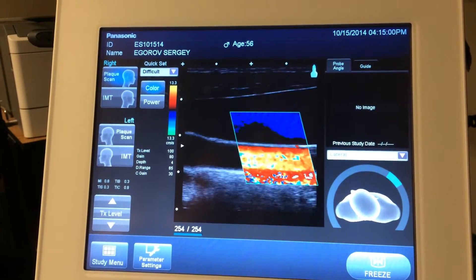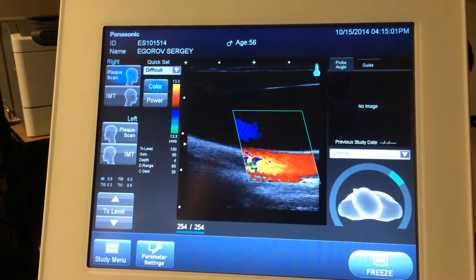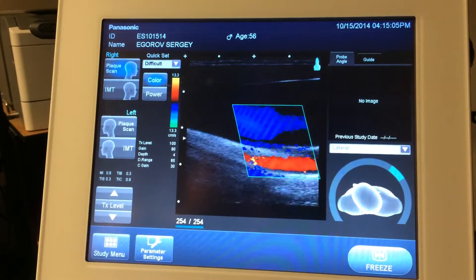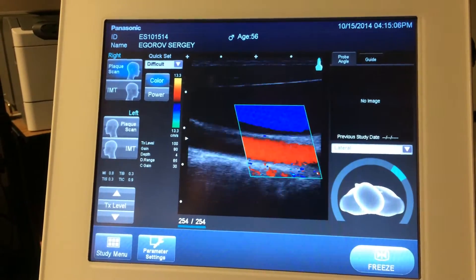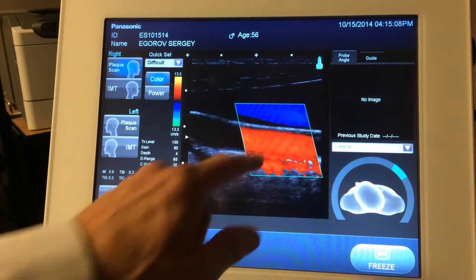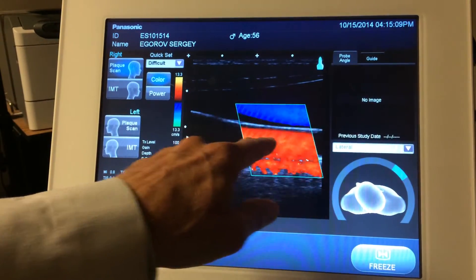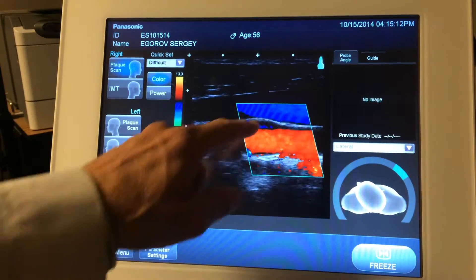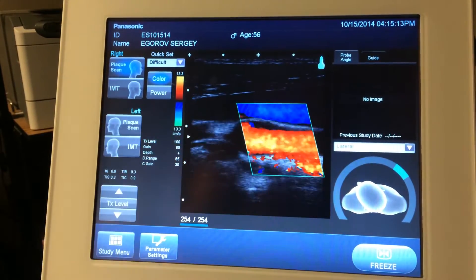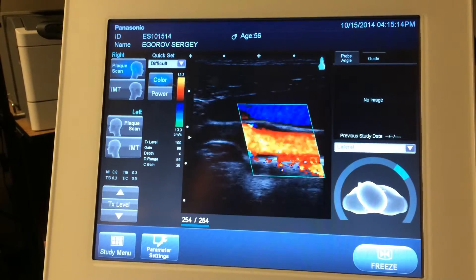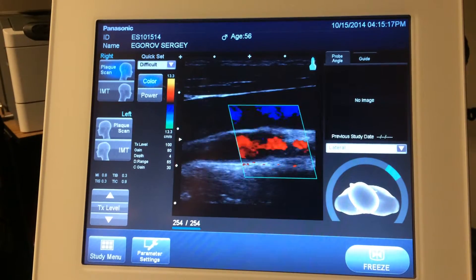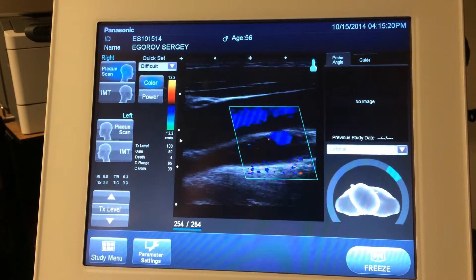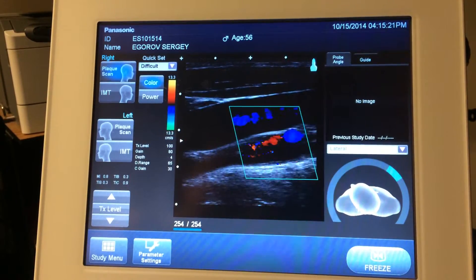And we go back this way. So we can follow your artery down towards the base of your neck, or we can follow it up towards your head. This is called the common carotid. When we get to this point here, this is called the carotid bulb. That's where your artery bifurcates into two arteries — external and internal carotid.